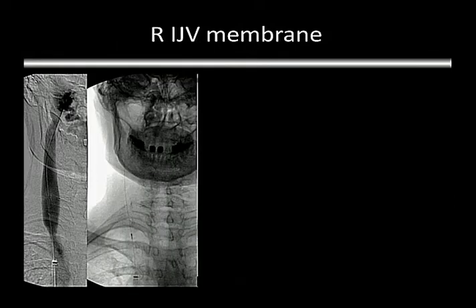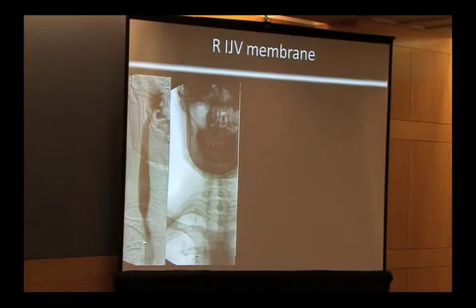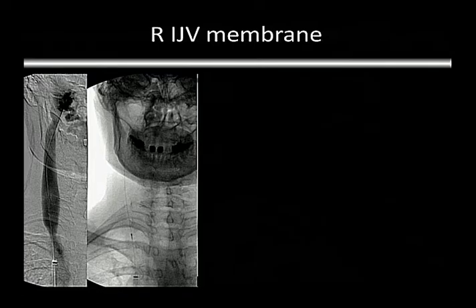This is the membrane that we talked about. I mean, where do you want to put the balloon? I guess you could just put a big balloon and put it here. But what I find is that it's quite common for the innominate vein to be much larger than the jugular vein. So I can take a long balloon, or as long or short as I need, and I can place it eccentrically on this area. So I don't have to dilate this whole area, because most of this is normal. There's a focal point of stenosis, and everything above it is normal. So if I can avoid bringing the balloon up to this area and have most of the balloon down here where it's really not going to touch the wall, I think I have less risk of injuring the wall of the vein. So I think that's a helpful thing for me.